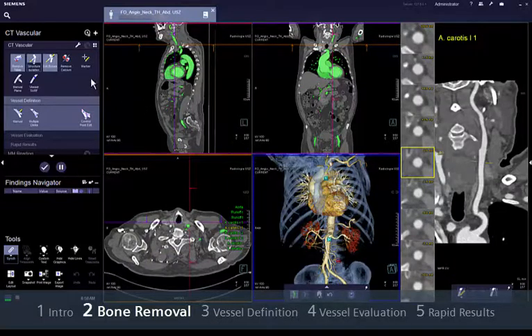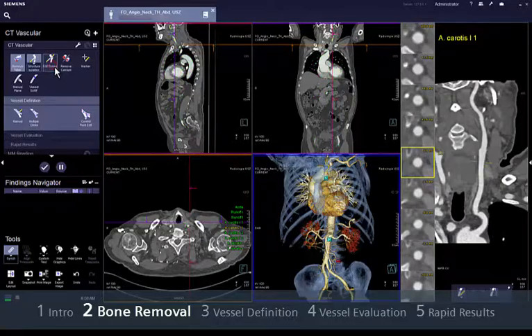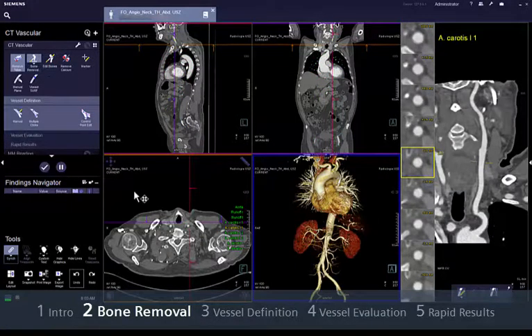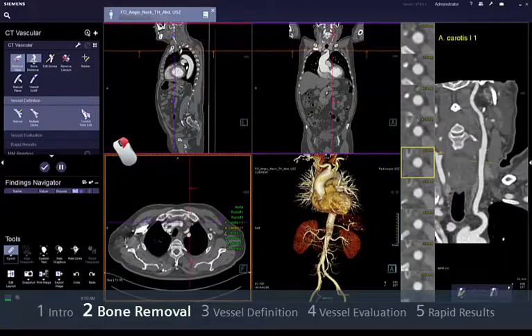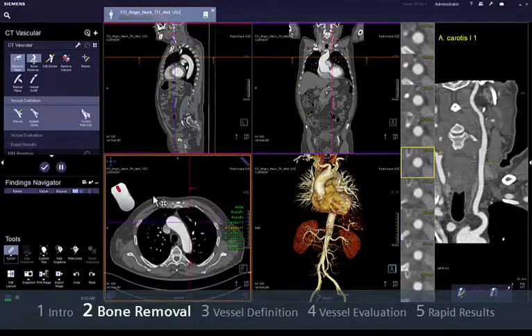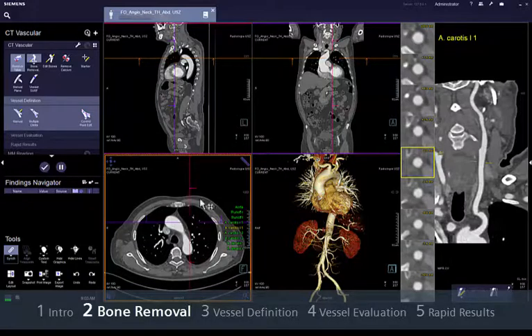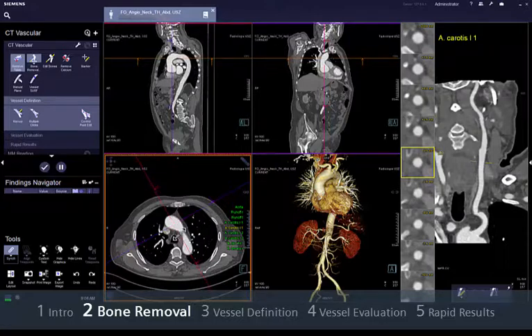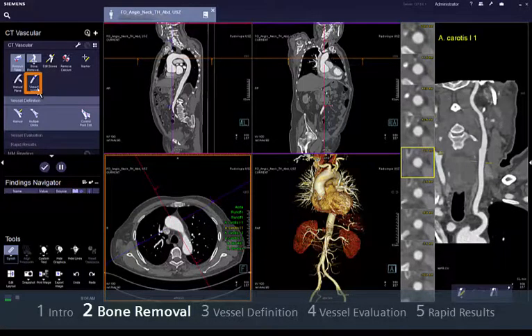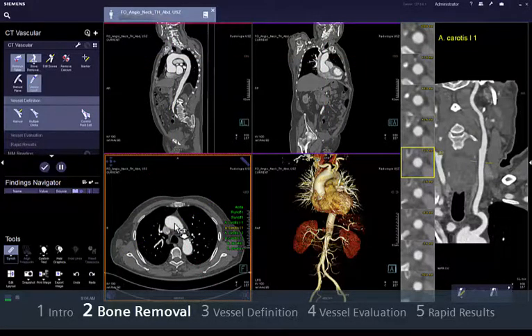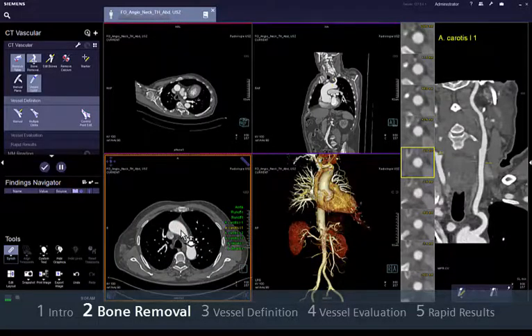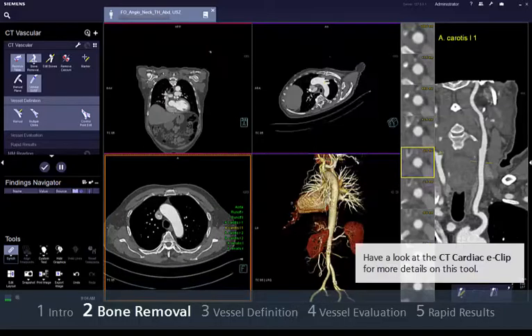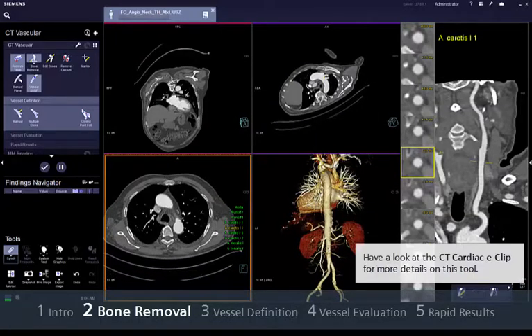After checking Bone Removal, you might want to have a first look at the NPR segments. Notice that you can navigate by pressing the right mouse button and dragging vertically or by scrolling the mouse wheel. You can also move or rotate the reference lines to look for a specific orientation. The Vessel Surf tool allows immediate 3D navigation even without the existence of centre lines or in occluded vessels.